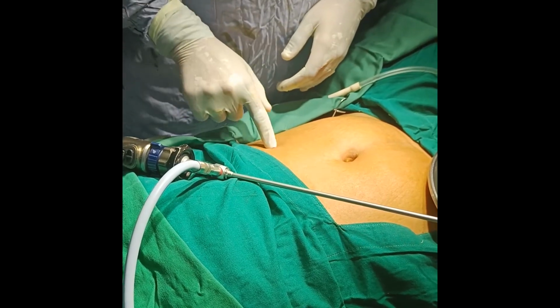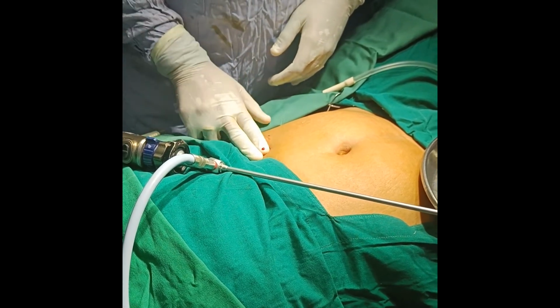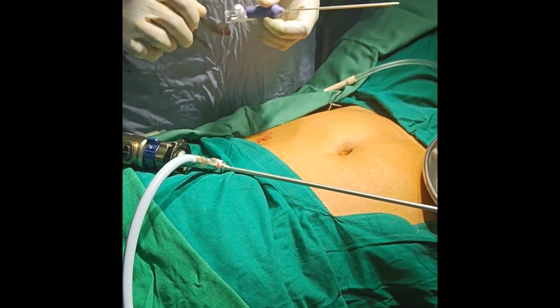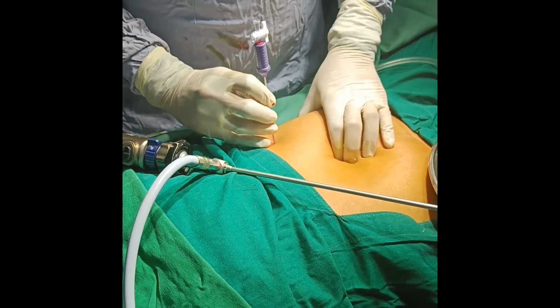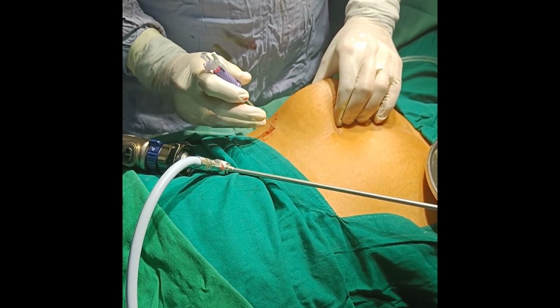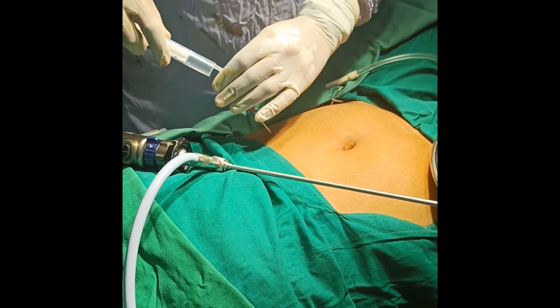So as we can see, I'm entering at the Palmer's point in the mid-clavicular line, 2 fingers below the subcostal margin. I have taken my stab incision there, and now I'm checking my Veress needle for the spring mechanism. Now I will fix it to the rectus sheath and then pass as I hear the clicks. I have heard the last click at this point and I'm stopping pushing because I've got the loss of resistance.